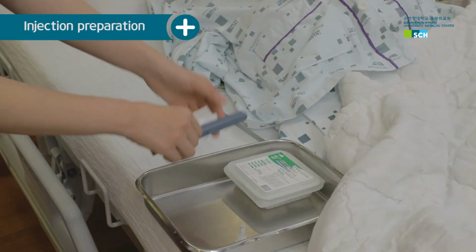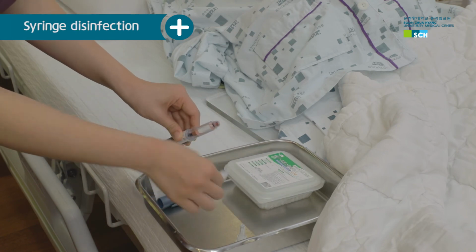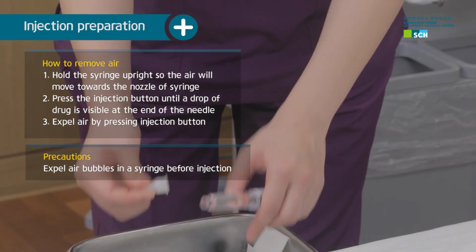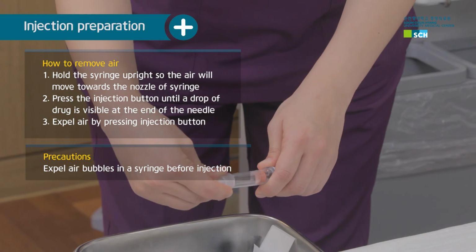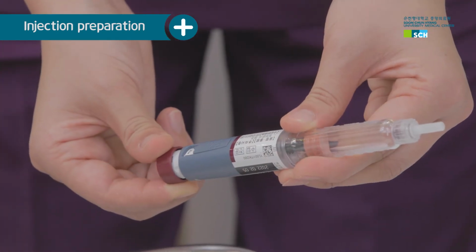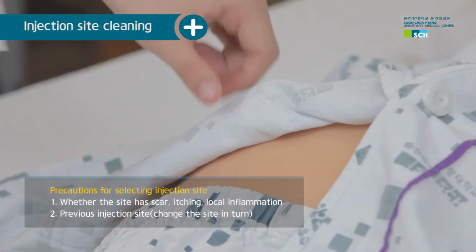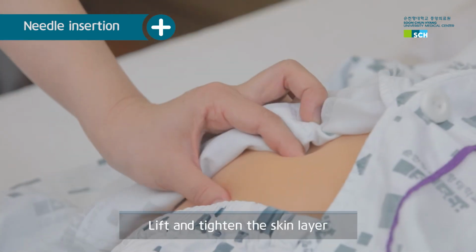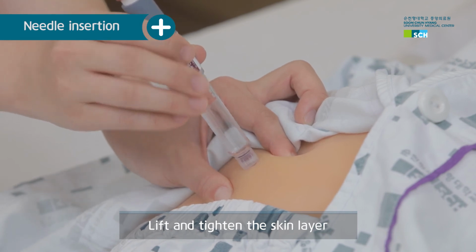Remove the insulin pen cap and wipe the top of the pen with an alcohol swab to clean the area. After disinfection, screw the needle tightly onto the top of the pen and remove the cap. Set the dose for the drug. Clean the injection site with alcohol swabs using circular motions moving from the center outward.